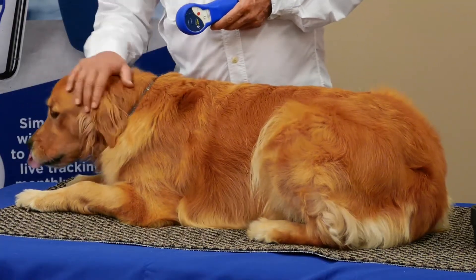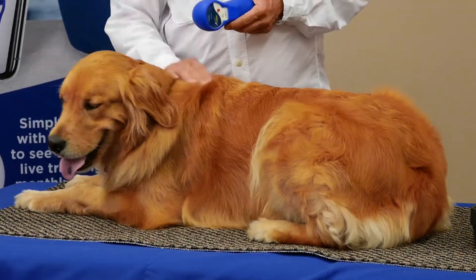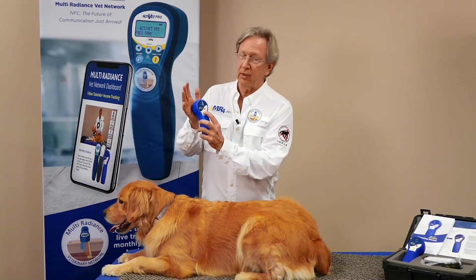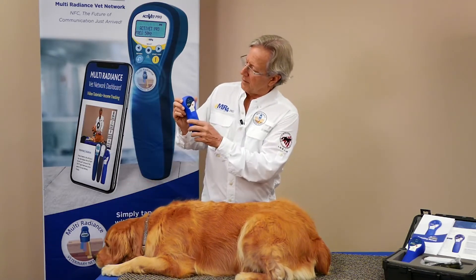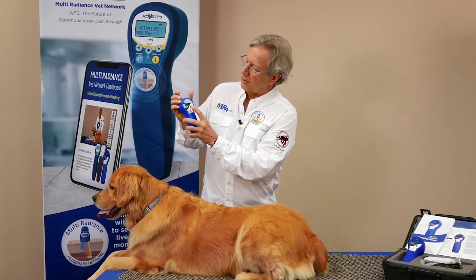Today we have Tango with us. Tango is a precocious young female, a really sweet dog. This is so easy to use — you just hold down the power button, have your hand over the front of the emitter. When the power is up it's ready to go, and then you can change your program by touching the button over here.